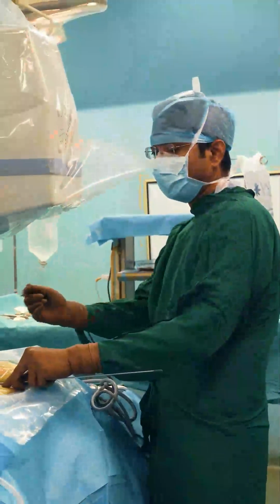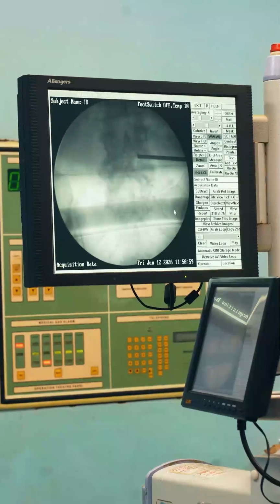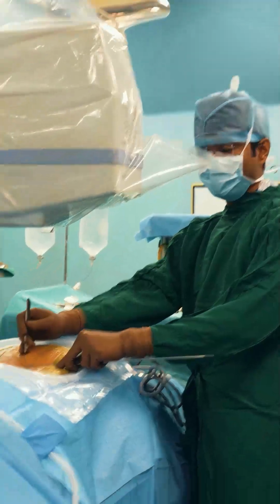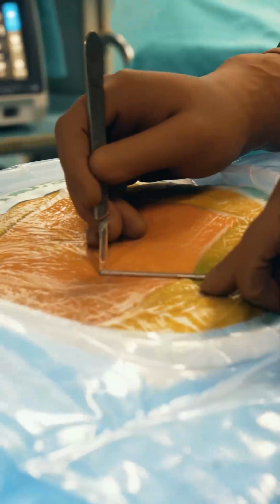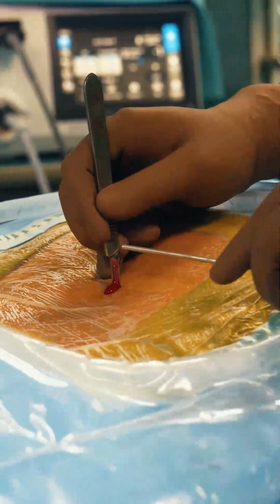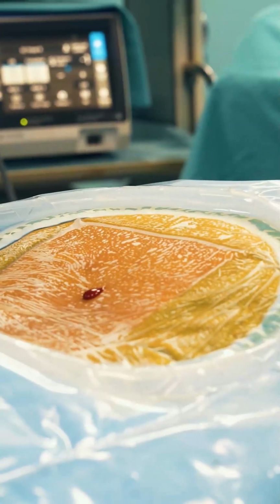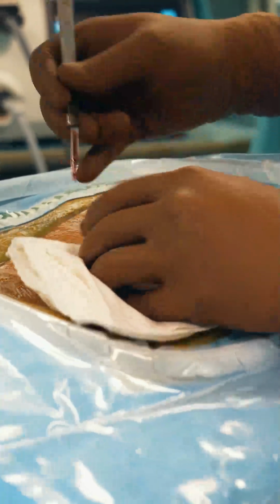And let's see what happens inside the surgery. So you can see, this is the C-arm picture, this is the L4, L5 interlaminar window through which we will enter. So I will just do a stab incision here, you can focus here. So just a stab incision, then you can go inside. So I am cutting the fascia a little bit. We got the fascia as well.